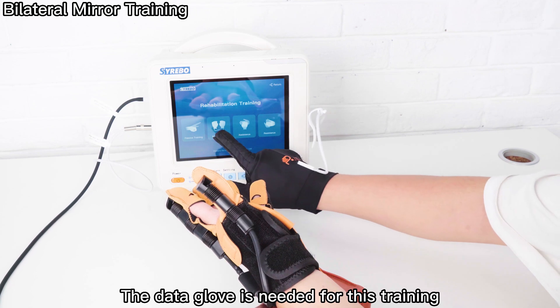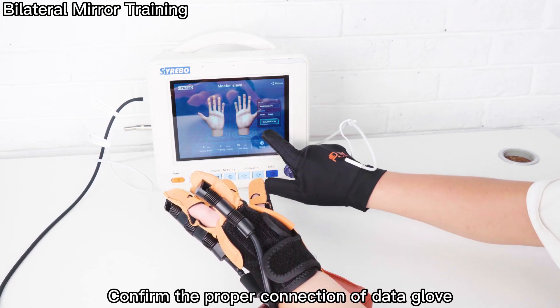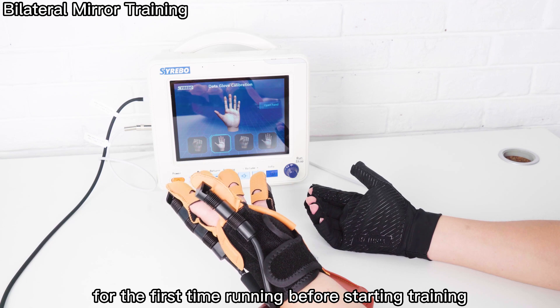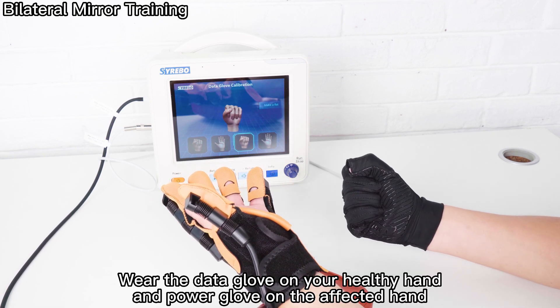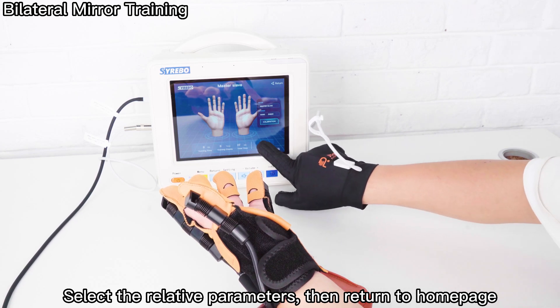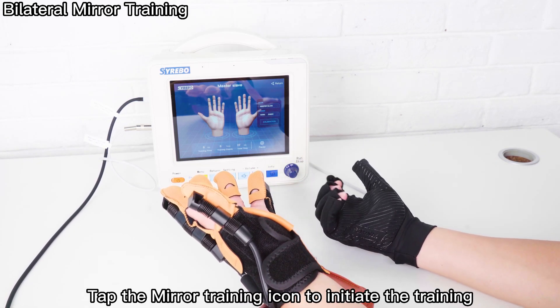The Data Glove is needed for mirror training. Confirm the proper connection of the Data Glove and calibrate it by tapping the Data Glove calibration icon for the first time before starting training. Wear the Data Glove on your healthy hand and the Power Glove on the affected hand. Select the relative parameters, then return to the home page and tap the mirror training icon to initiate the training.